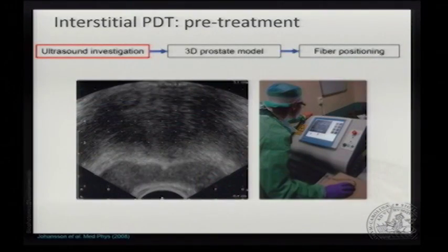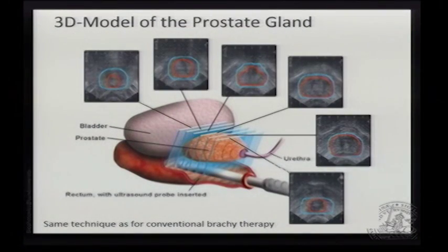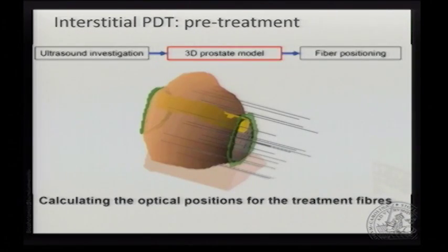That is roughly the plan. Going into a little more detail, we first take an ultrasound investigation and try to find out where the prostate is and what region we would like to ablate. This imaging is done with transrectal ultrasound. You take different slices, look at each slice, and outline where the prostate is. From all of these slices, you get a volume like this.